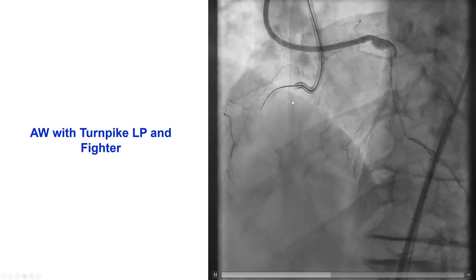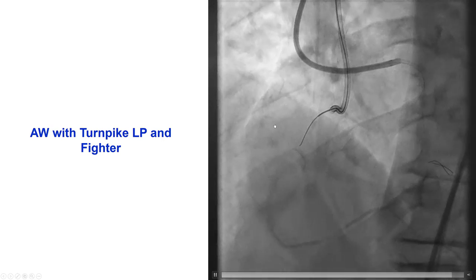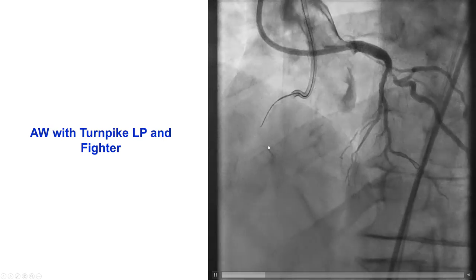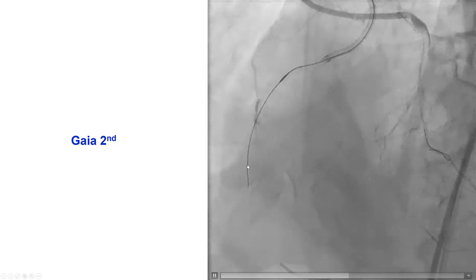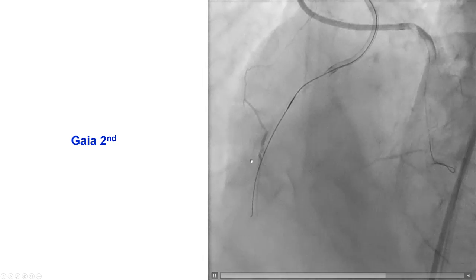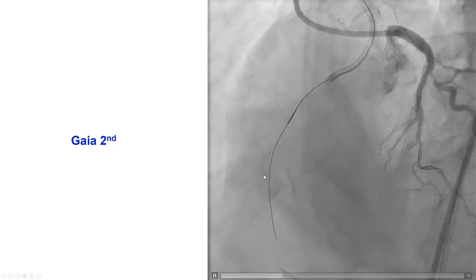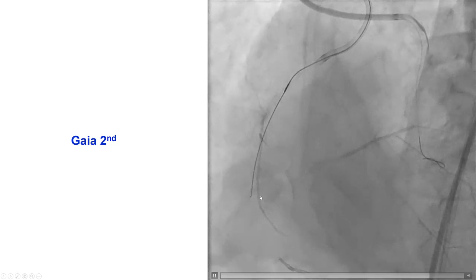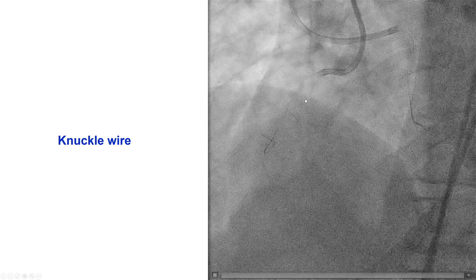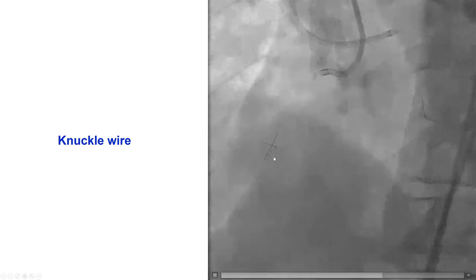We did antegrade wiring with a Turnpike LP and a Fighter — a polymer-jacketed, soft tapered guide wire. We could not make much progress and switched to a Gaia second. The Gaia second was actually outside the vessel architecture, highlighting the importance of the dual injection to minimize any perforations. We pushed the microcatheter through and tried antegrade again, but the wire seemed to be knuckling in the mid-RCA and we had a hard time advancing it further down.